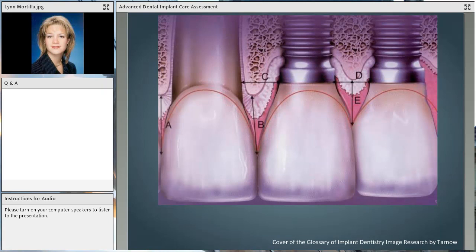and tissue to grow down. We will look at the contact areas between teeth or prosthetics so that the soft tissue, if these are individual implants or a crown and bridge case, will look very natural, so that these crowns or prosthetics look like they're coming out of the tissue. We know this beyond a shadow of a doubt.